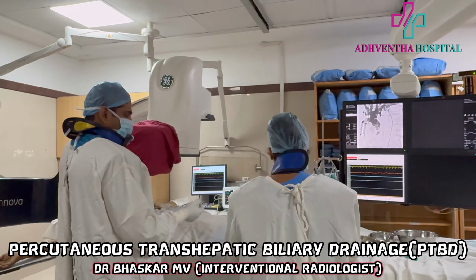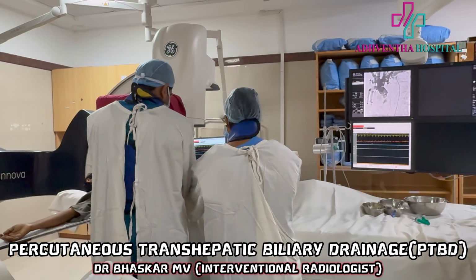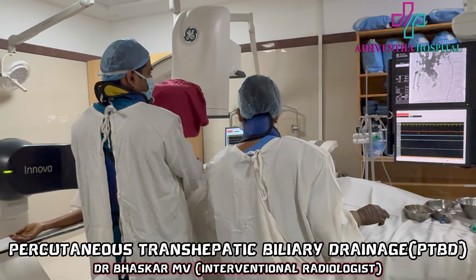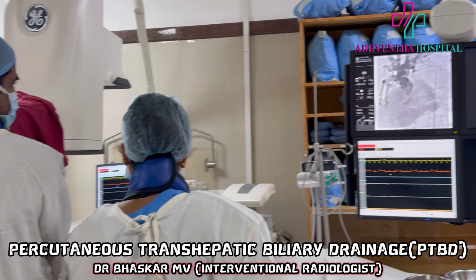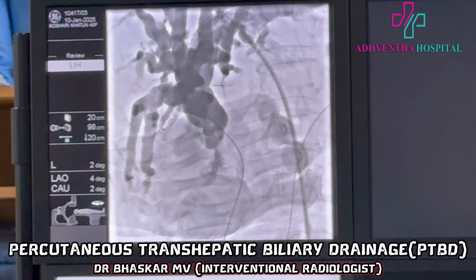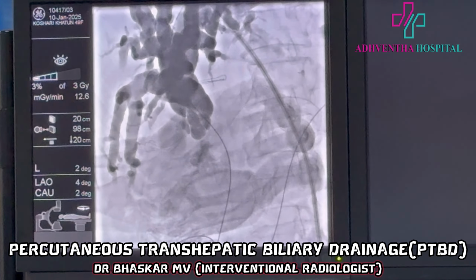In advanced cancer where surgery cannot be done immediately, we can do this procedure to reduce the biliary jaundice and enable the patient to get the surgery.